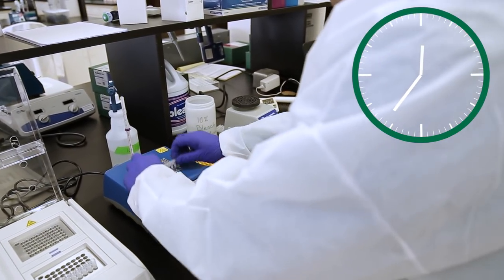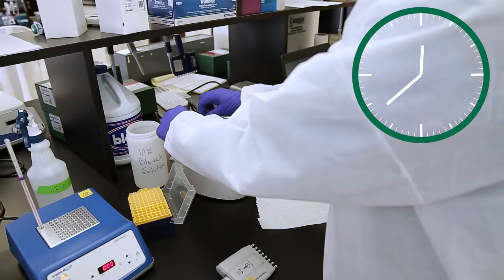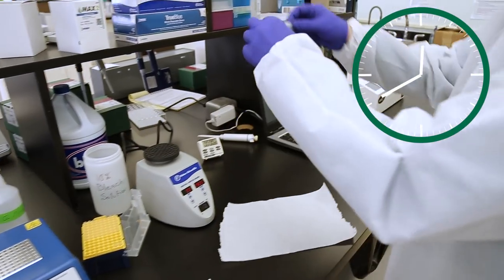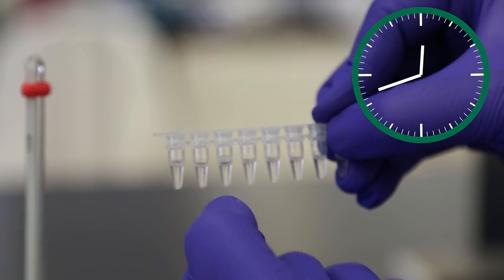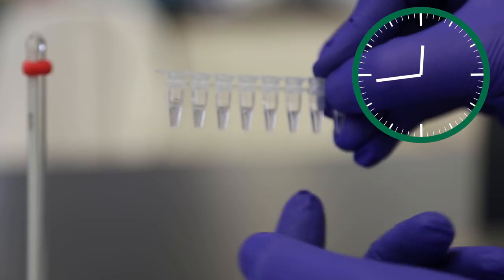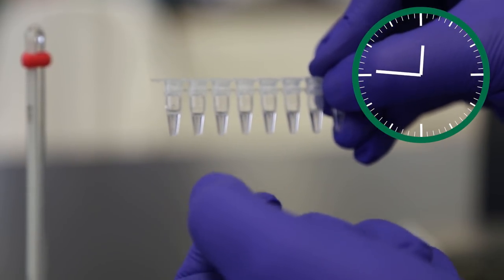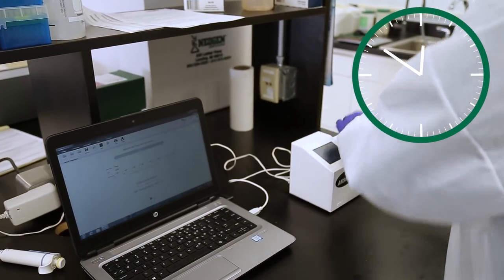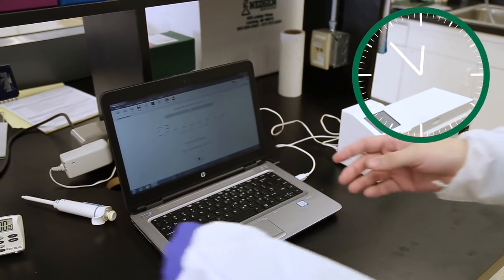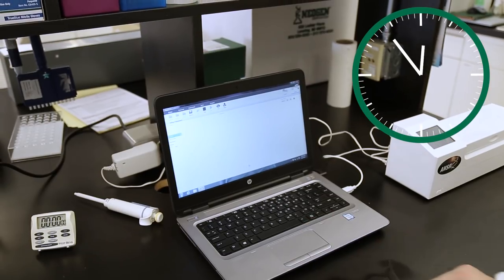Remove the reaction tube from the 56 degrees Celsius heat block and vortex it briefly. Check the reaction tubes for bubbles that might be at the bottom or in the middle. If you see any, give the tubes a light tap to release the bubbles to the top. Bubbles on the top are fine. Quickly place the tubes in the reader and close the lid. Remove your glove and press the play button on the answer computer.